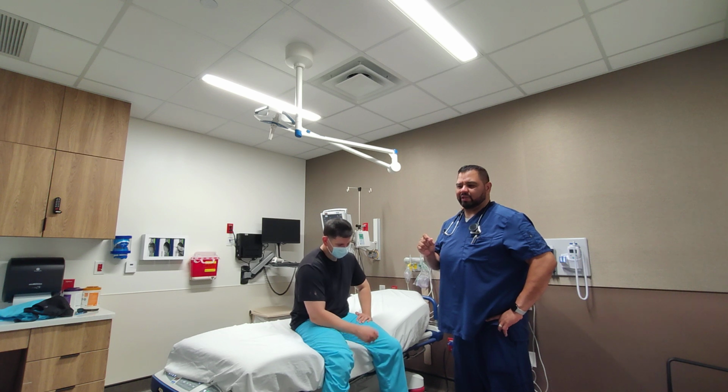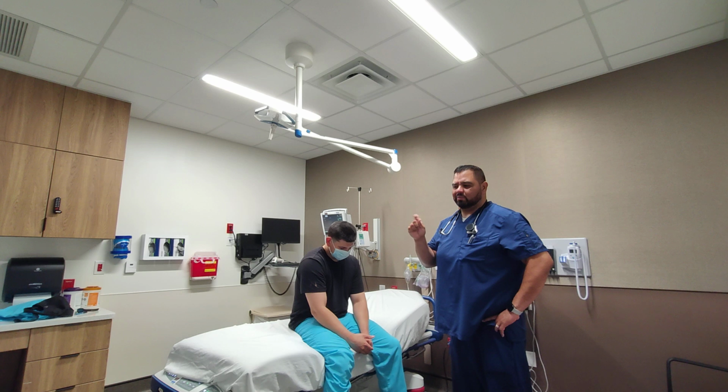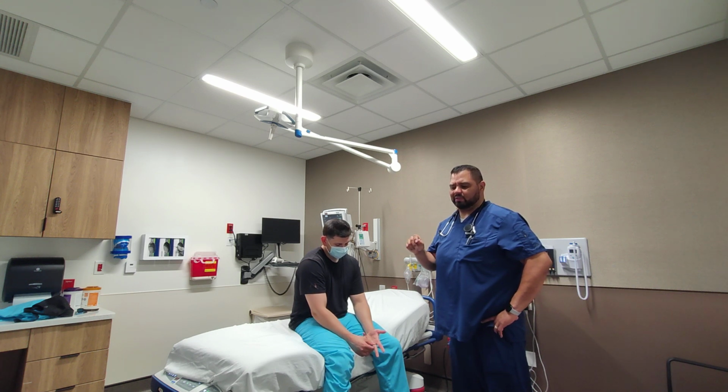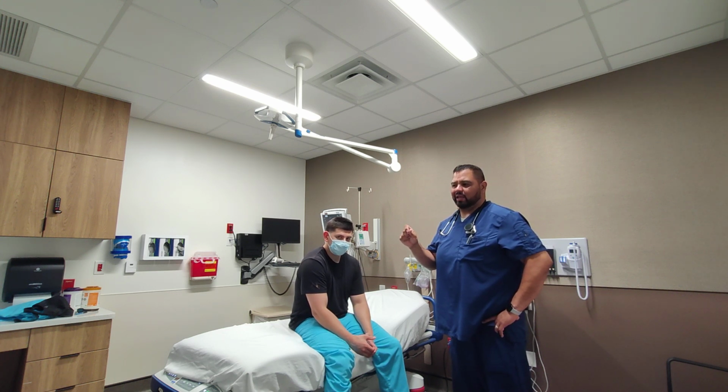Then after we get finished inspecting the vagina, we'll get the broom for the pap smear test, and we'll sweep the cervix, and then we'll send that off to the lab for any kind of results, any abnormal results. After we get through doing that, we will loosen the speculum, take it out, and then finish with the pelvic exam.